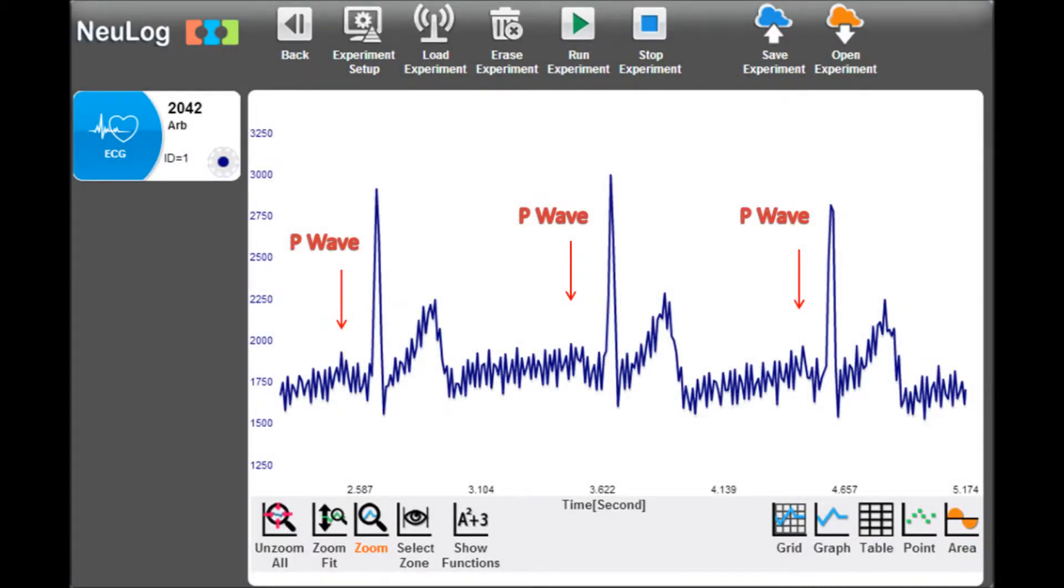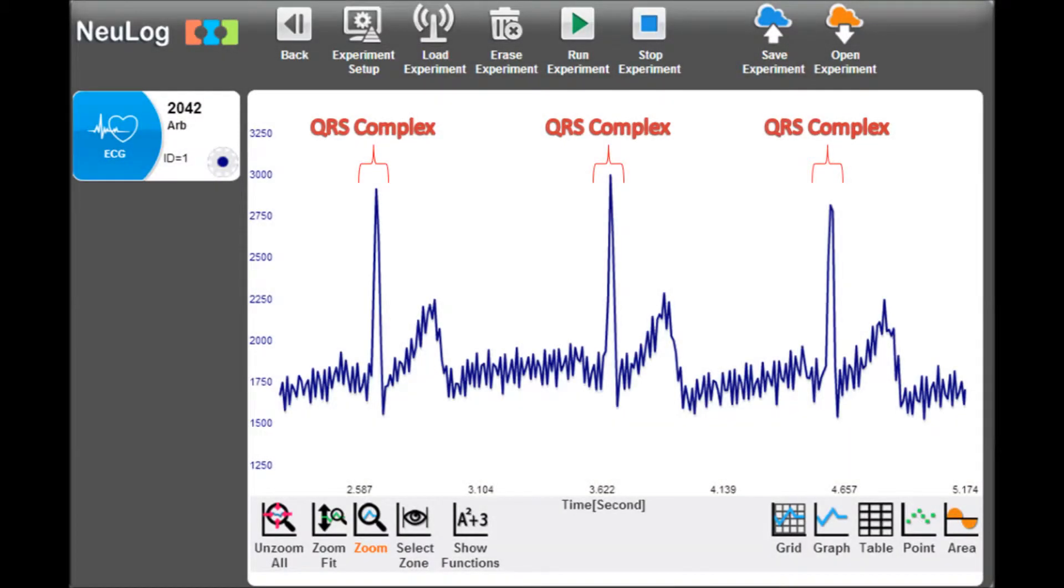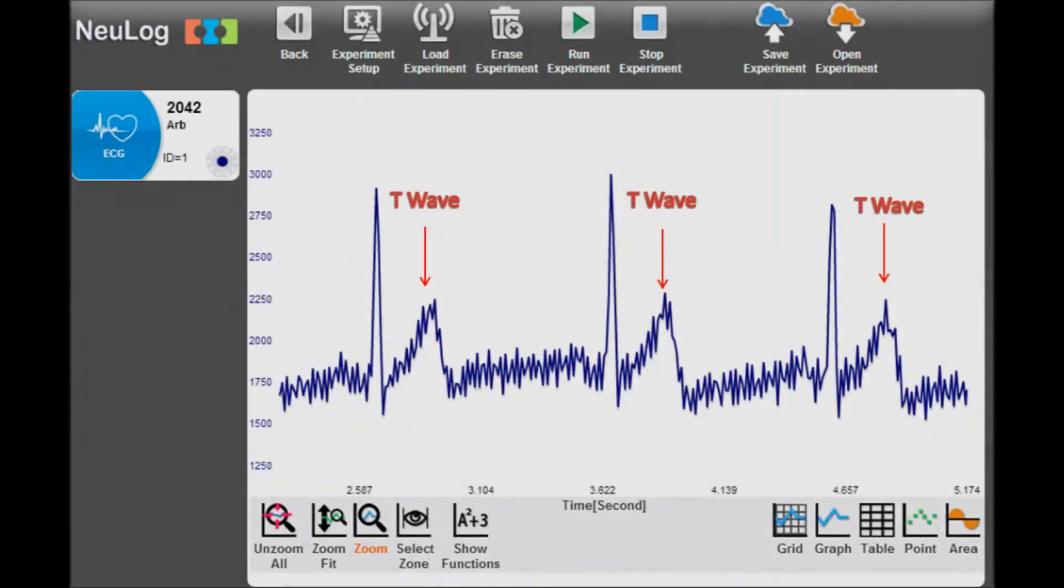The P wave where atrial depolarization occurs, the QRS complex where depolarization of both the right and left ventricles occur, and the T wave is the repolarization of the ventricles.